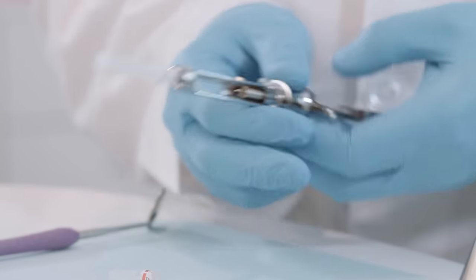The MSA nerve block would be given if you have administered other injections in the maxilla and find that the first molar is not anesthetized. However, only about 28% of the population even have the MSA nerve. A separate supraperiosteal injection over the maxillary second premolar or mesial buccal root of the first molar is required to ensure complete anesthesia of the first molar — this is the middle superior alveolar field block. It will anesthetize structures innervated by the middle superior alveolar nerve when present, including the pulp of the maxillary first and second premolars and their facial soft tissues.